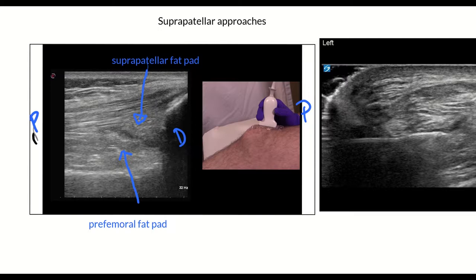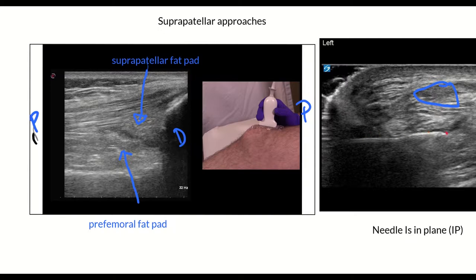The fat pads are laden with nociceptors and are rather painful when you put a needle in them. When you start doing these knee injections, you'll see that most of the pain occurs when the needle is caught in the proliferative synovial tissue and in these fat pads. The usual needle approach is short axis on the quadriceps, and the needle is placed in-plane. Here we see the quadriceps tendon circled in blue.